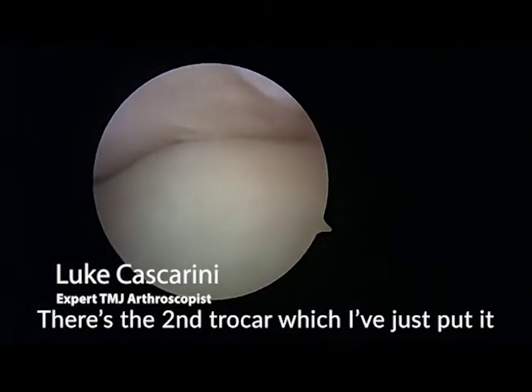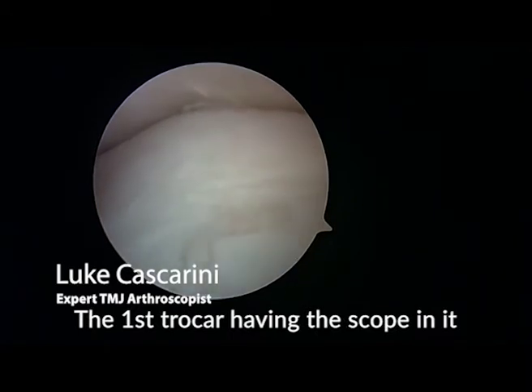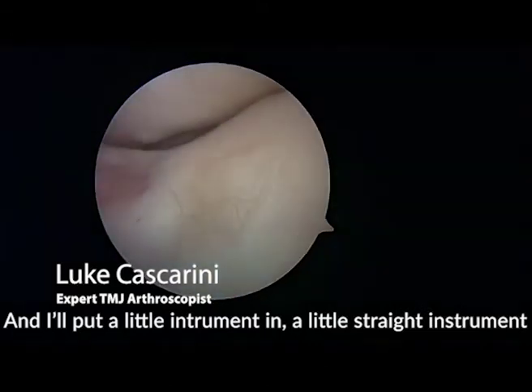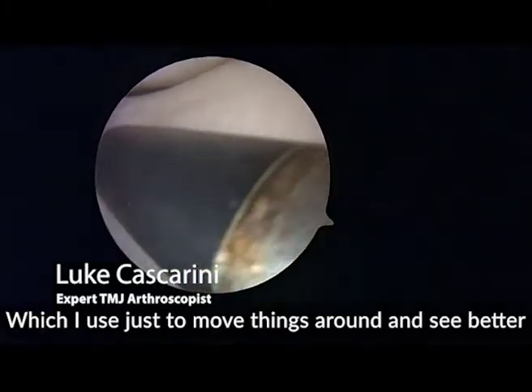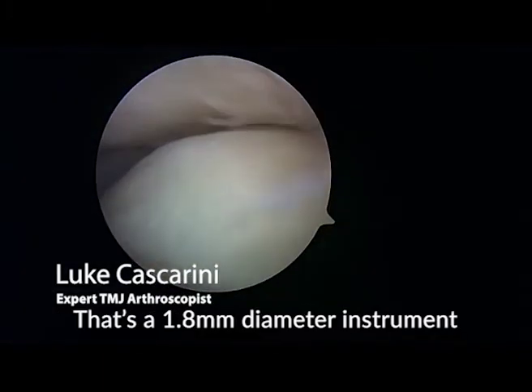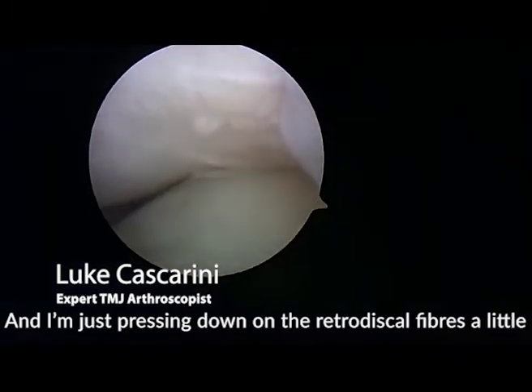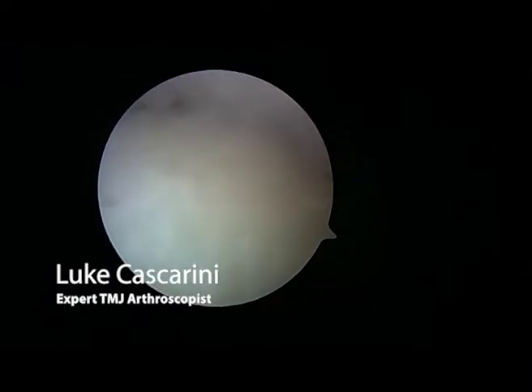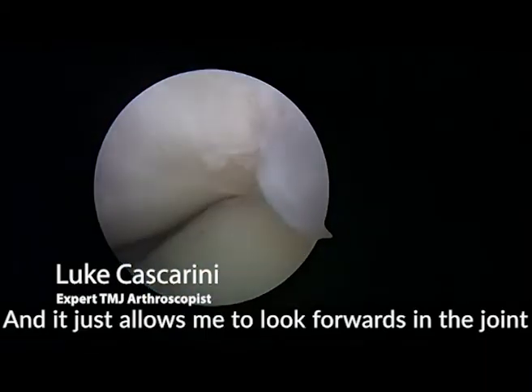There's the second trocar which I just put in, which is in front of the first. The first trocar has the scope in it, and I'll put in a small straight instrument which I use just to move things around and help me see better. That's a 1.8 millimeter diameter instrument. I'm just pressing down on the retrodiscal fibres a little, which allows me to look forwards in the joint.